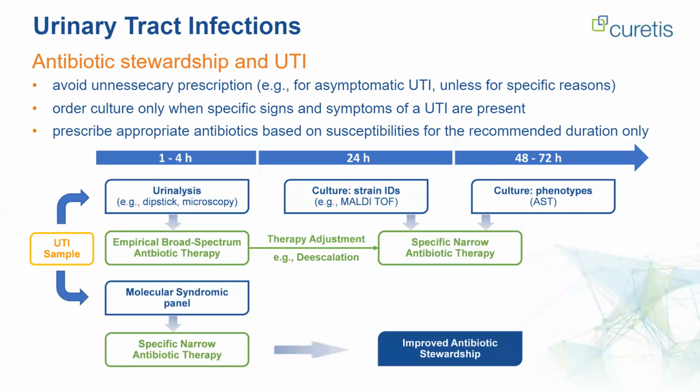Yes, we had this when I showed the clinical study data and talked about the positive predictive value. It's obviously clear that in many cases the molecular panel will not match, or not fully match, the culture results. But I think this is a more fundamental issue relevant for all molecular panels in general, because it's not only that the results are different, it's a completely different type and quality of results.